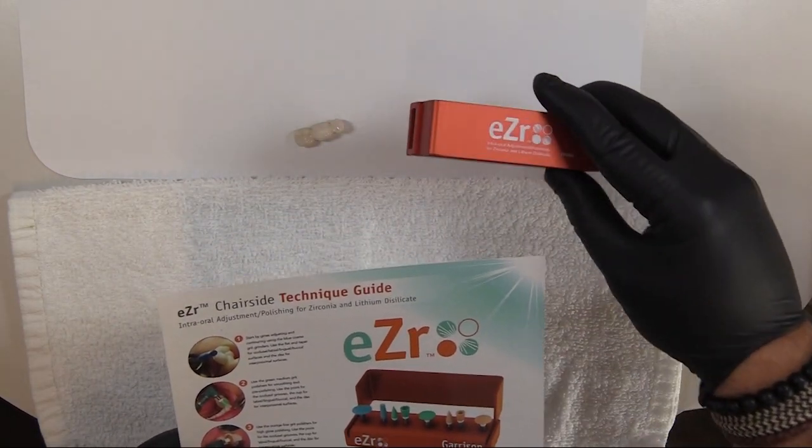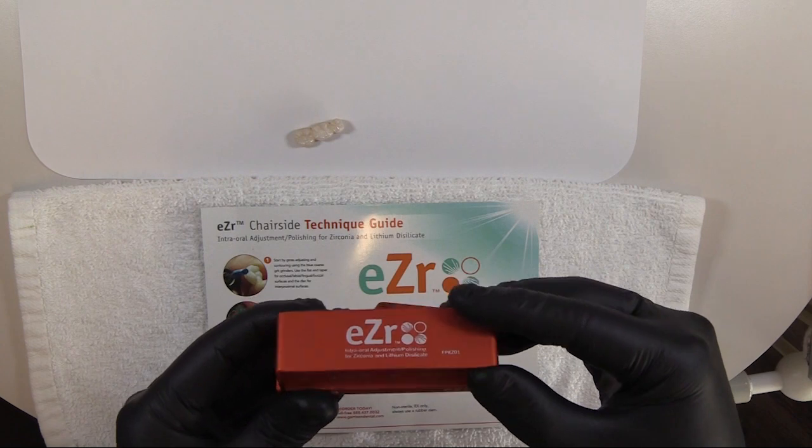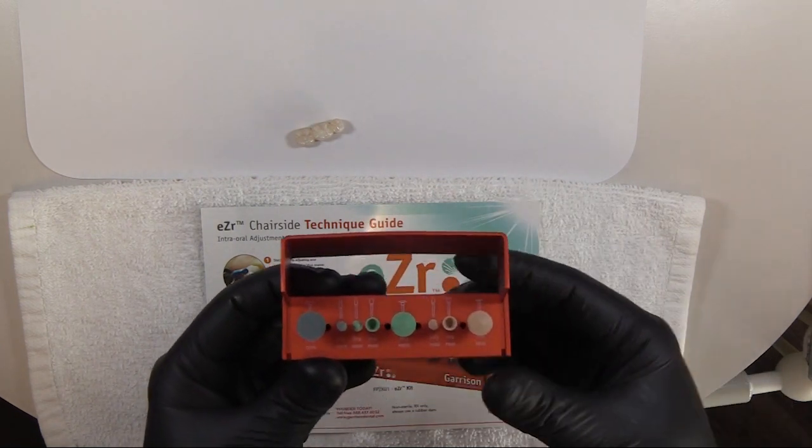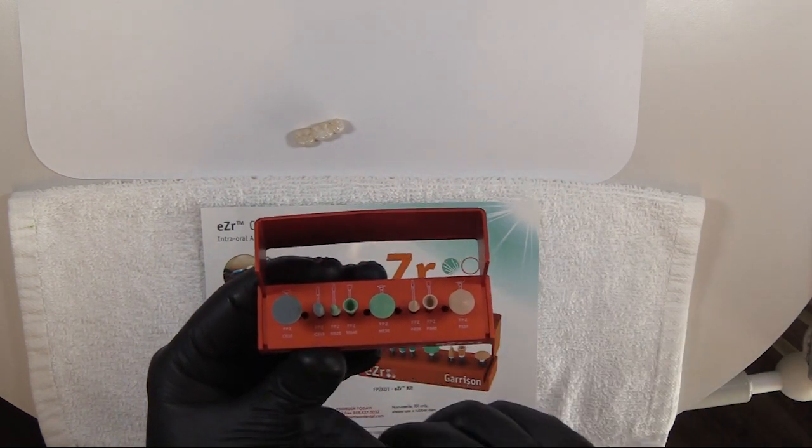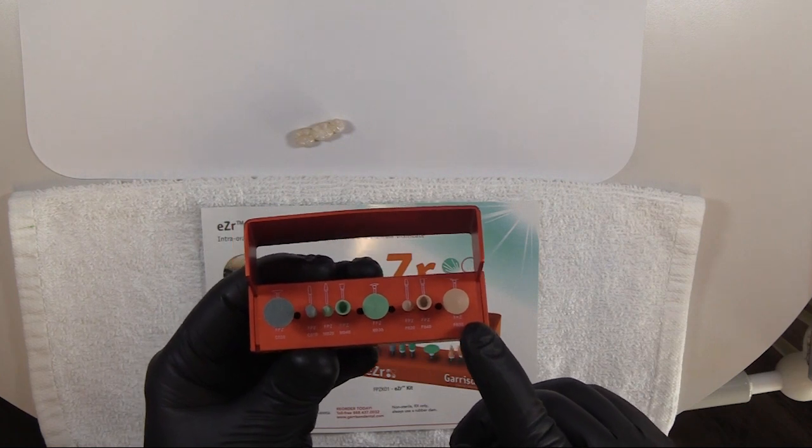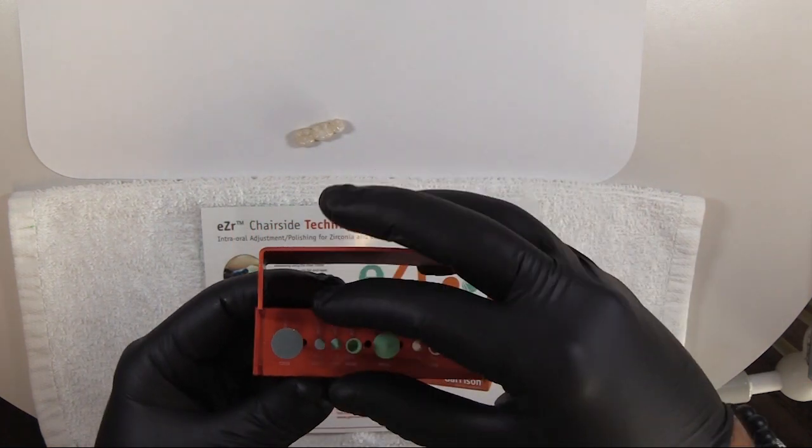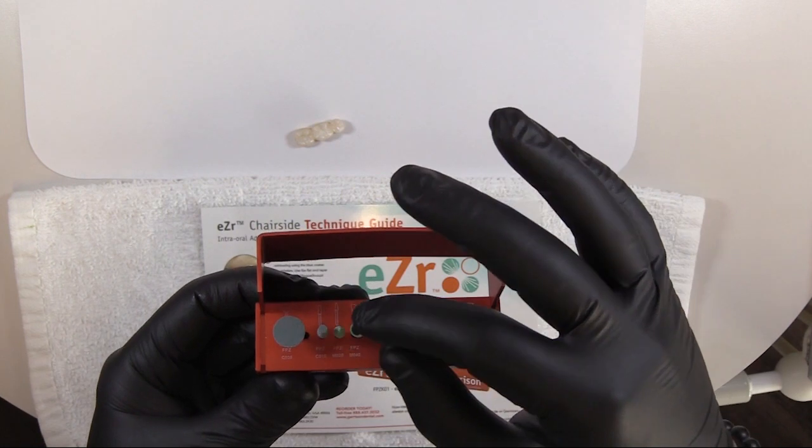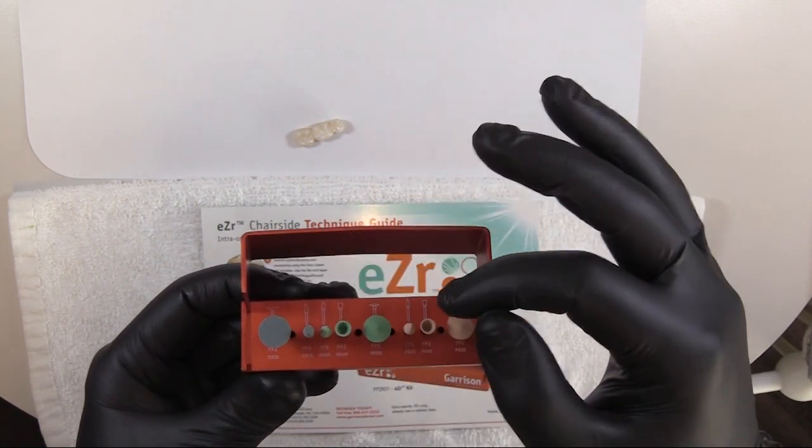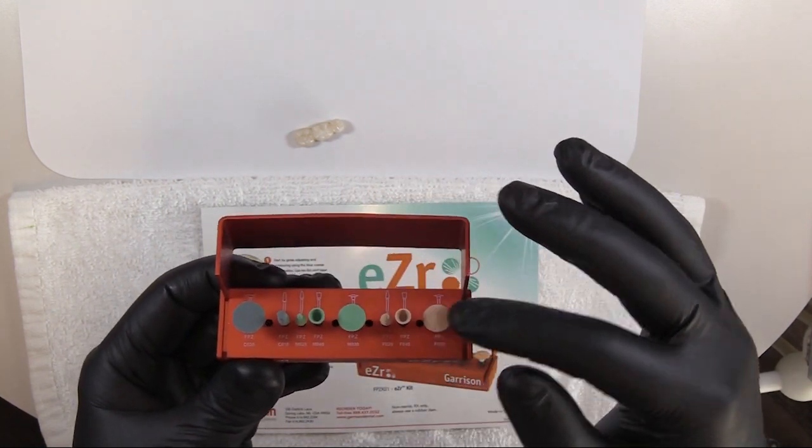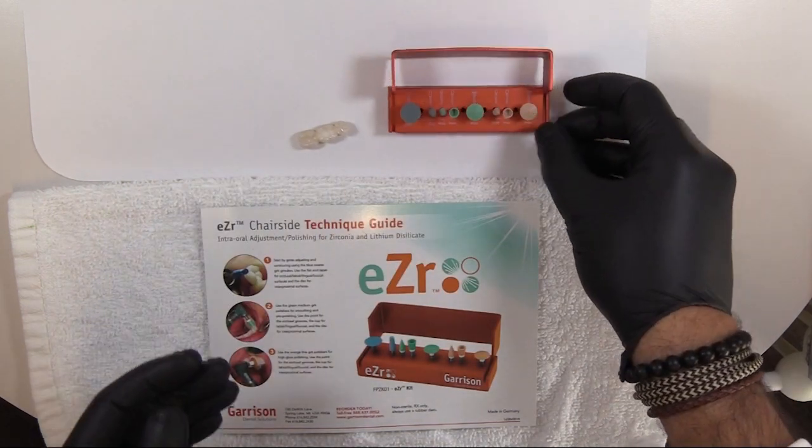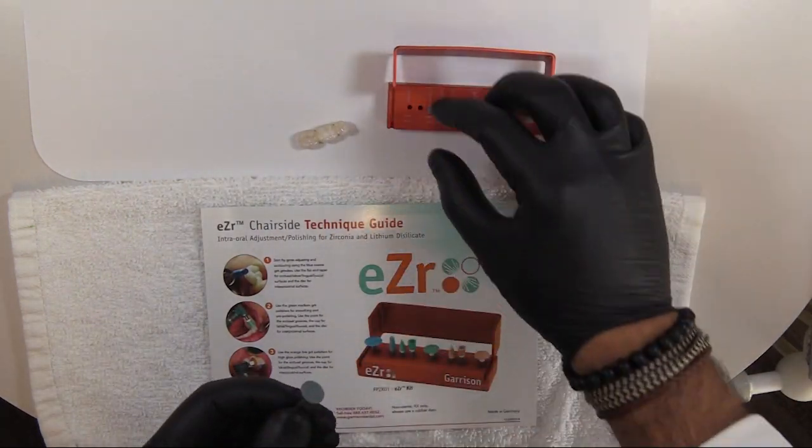This is the EZR zirconia and lithium disilicate polishing kit. As you see when you initially uncover it, there are three stages of polishing: the blue rubber coarse grit grinders, the green medium grit polishers, and the orange fine grit. Let's briefly go through the reasoning or rationale of each one.